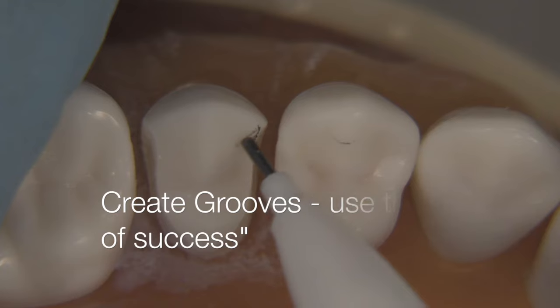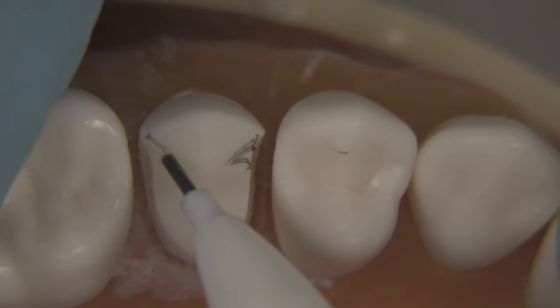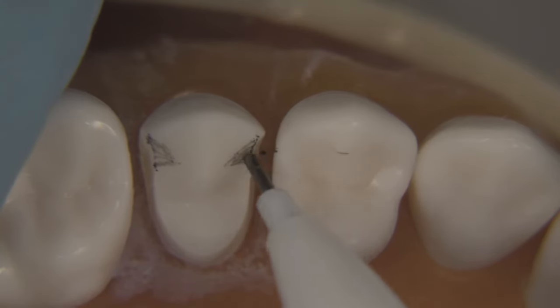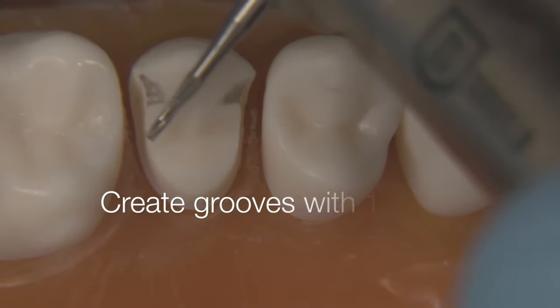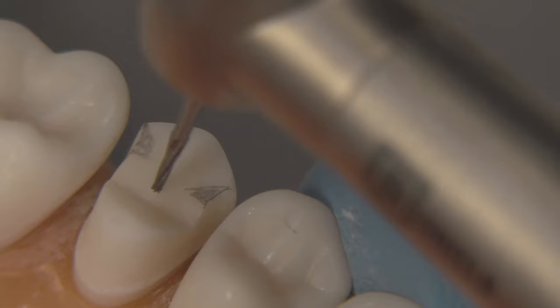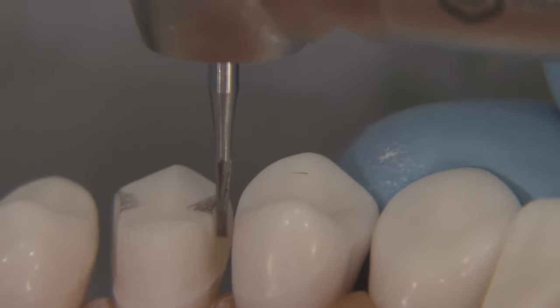The grooves — I'm using the pencil again to demonstrate the location of what we call the triangle of success. We follow the flare in towards the tooth and then cut back at a right angle to the axial wall. That little triangle in the middle is about the size of a 169L bur, which is what we're going to use to create the grooves. Hold the bur in the long axis of the preparation, making sure you aren't tipping it too far mesio-distally or bucco-lingually. Line the bur up nice and even, take a deep breath, and get things lined up.